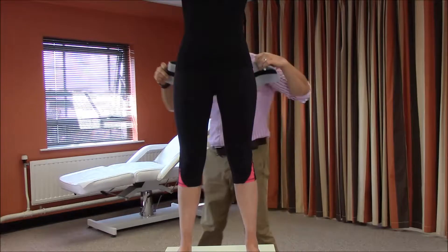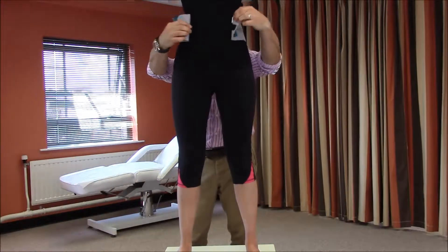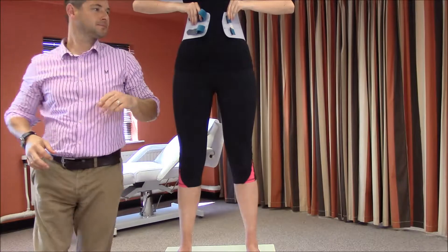Determine whether you wish to use a unilateral or bilateral design, and begin by donning the elasticated abdominal support around the waist.